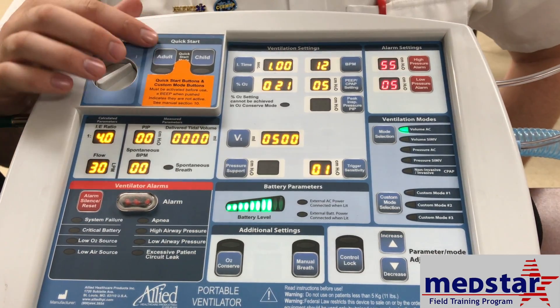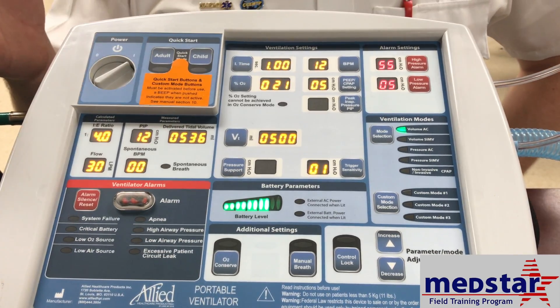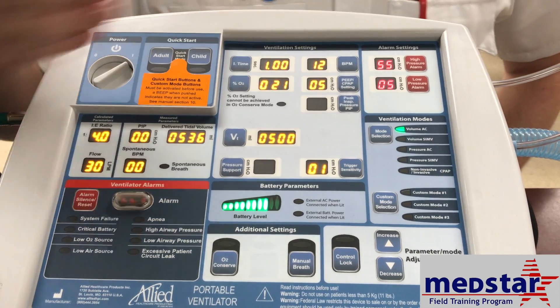There is a quick start menu for the most common adult and child settings. For the most part, you're going to get your settings from the respiratory therapist and adjust accordingly.